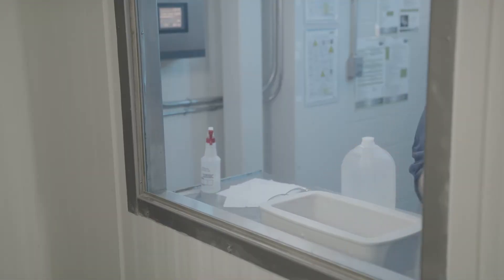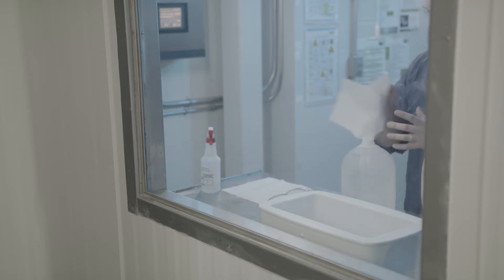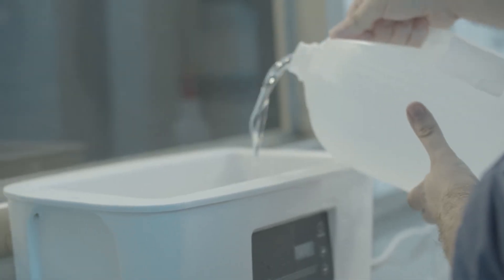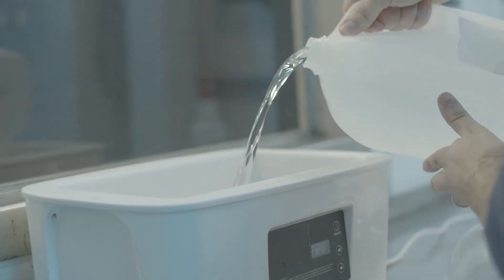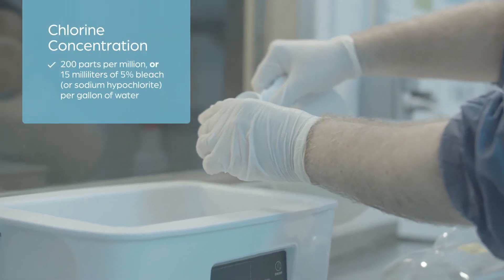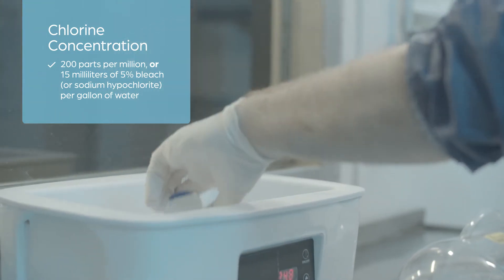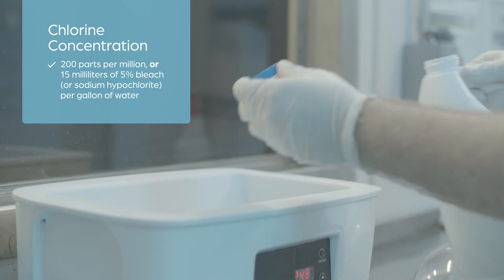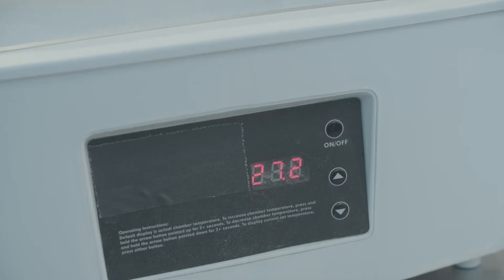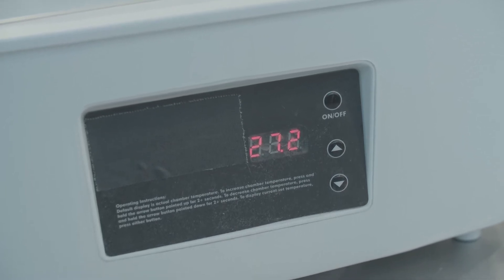Preparing the thaw bath is an important step in the vaccine preparation process. Wash the thaw bath with soap and water daily. Let dry and spray down with alcohol. Fill the thaw bath with distilled water. Add chlorine to the bath for a final concentration of 200 parts per million — 15 milliliters of 5% bleach or sodium hypochlorite per gallon of water, or 4 milliliters per liter of water.